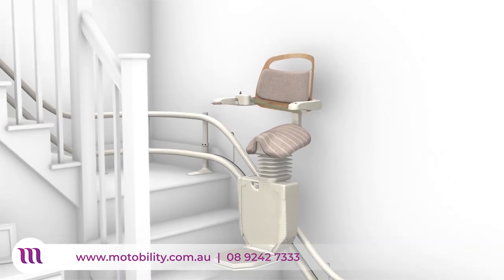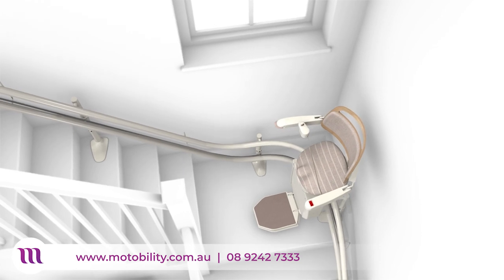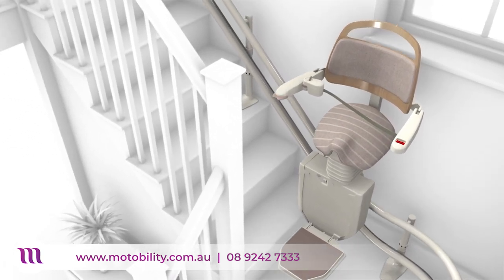Our simple, intuitive controls have been designed to suit all and are ideal for those with limited dexterity. Wall controls allow you to summon your Sadler stairlift from another floor, or perhaps send it up or down to someone else who wants to use it.